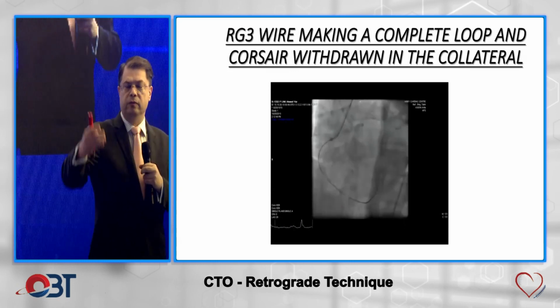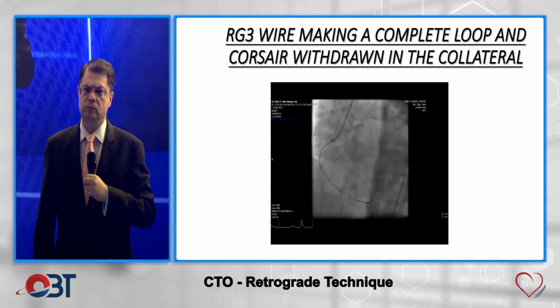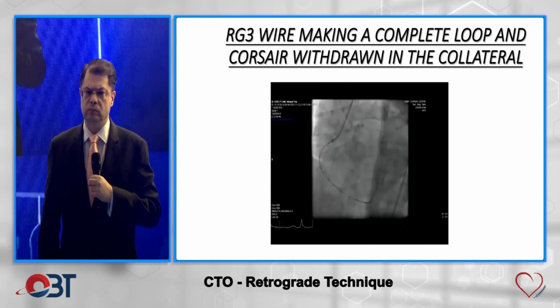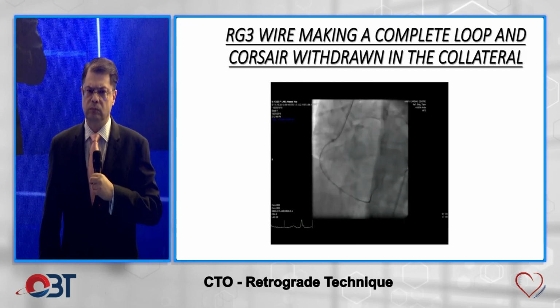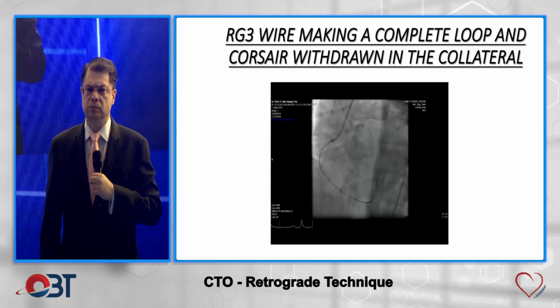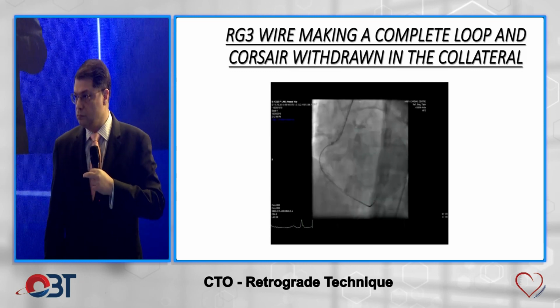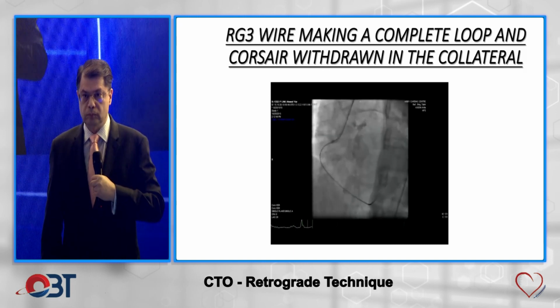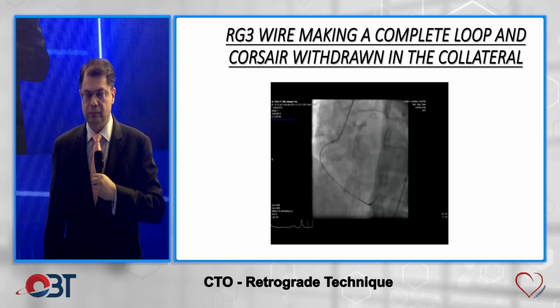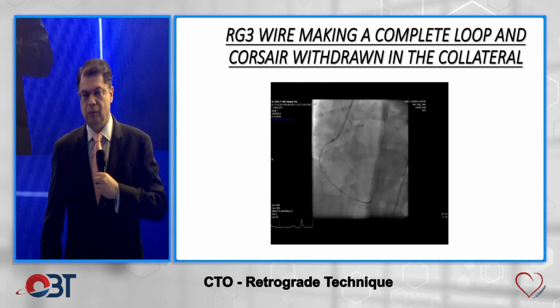Sir, my name is Dr. Hamza Zurghari. Just had a question. So, wonderful session regarding retrograde CTOs. We've talked about the algorithms, and we all know that we have algorithms like the hybrid algorithm, then the Asia Pacific algorithm, and then the Japanese algorithm in 2019. So how much time do we spend for the antegrade approach? Some say it's 20 minutes, 20 to 30 minutes. So how much time do we need to spend, or is there something else that we look for?